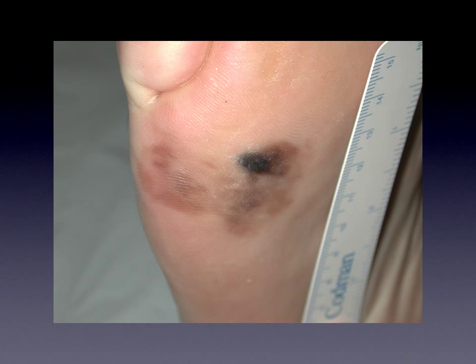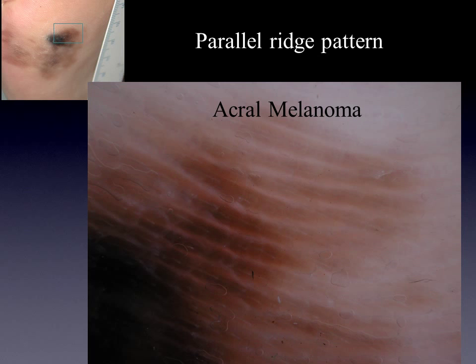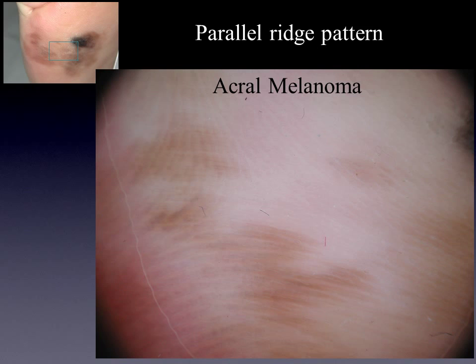Again we see this acral large macule with different colors. Now let's look in dermoscopy. We are here in this field of this large macule. The pigmentation is on the ridges — you can clearly see the pigmentation, while in between the furrows are non-pigmented. This is a parallel ridge pattern which is characteristic for an acral melanoma. Also in the fainter pigmentation area of this macule, if you look carefully you can again see this parallel ridge pattern, confirming this part is also an acral melanoma.